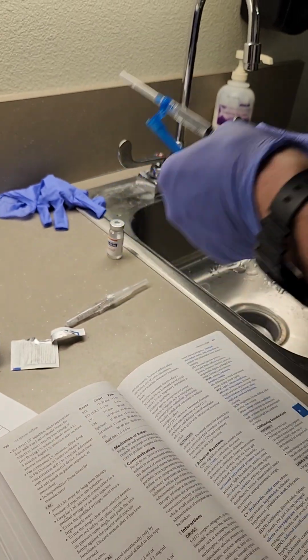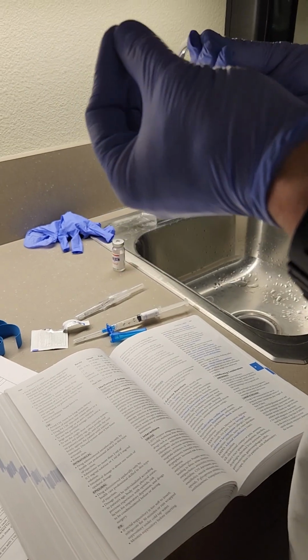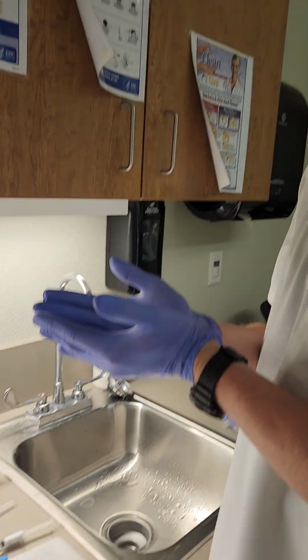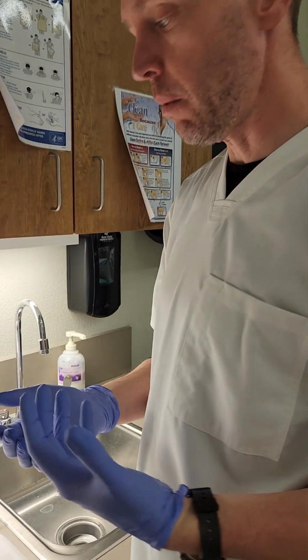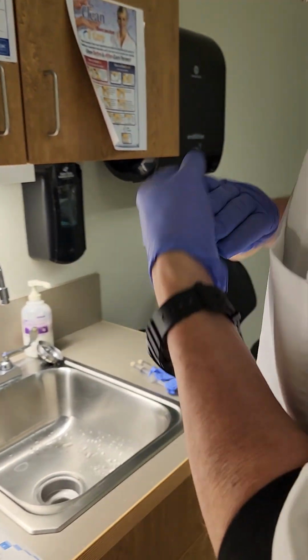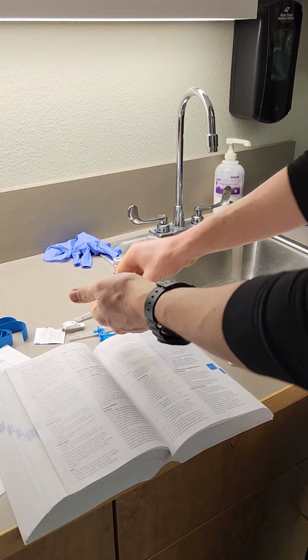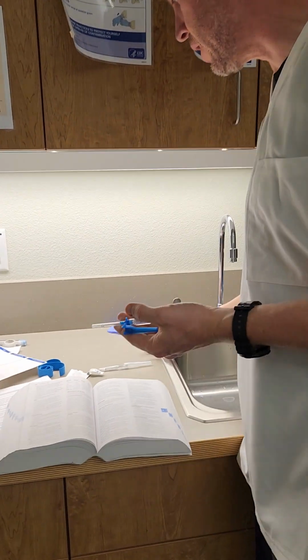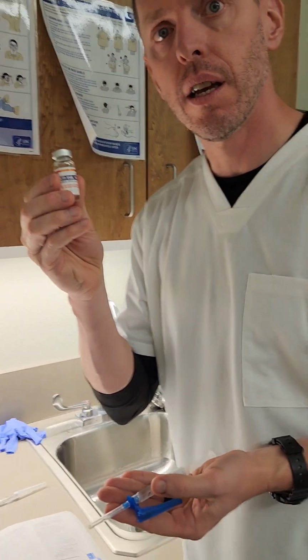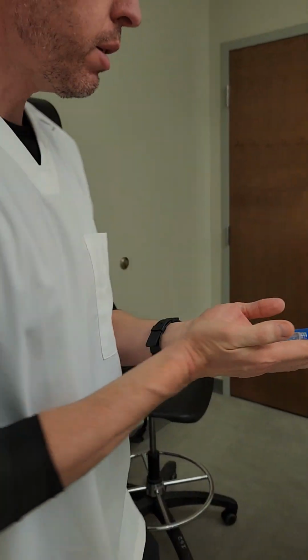Okay, so now I'll bring that, and I'll bring some saline with me to flush things as well. And so now I can take these off, and I put these in the saline with me. Nurse, can you help me dispose of this? Certainly. All right, thank you. All right, now we're gonna transport this over here.